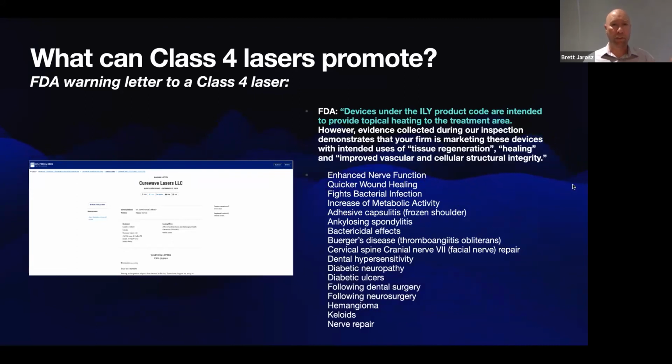So there's the misinformation that's out there, the poor choice of words within the literature around photobiomodulation, and yet that systematic review I just happened to polarize used all infrared wavelengths. That's not fair. That's got nothing to do with photobiomodulation as an actual therapeutic choice, because that doesn't include LEDs, that doesn't include low-level laser therapy, it doesn't include just talking about specific wavelengths. So hopefully we can start to see the differences between these various things.